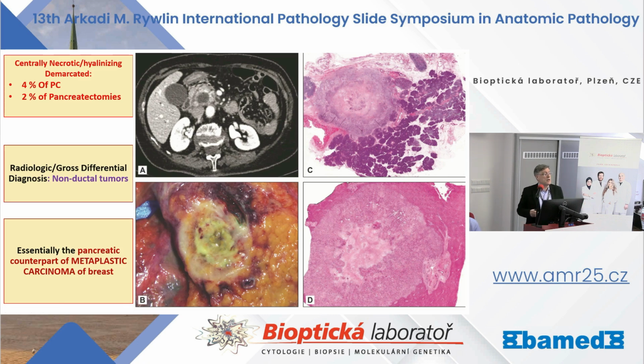Of course, metastases are often demarcated from whichever organ, doesn't matter, but in fact, PDACs, when they metastasize to liver, they may form compact, round things, but more typically they are more insidiously infiltrating, even in metastatic size, unlike other metastatic cancers in most examples.